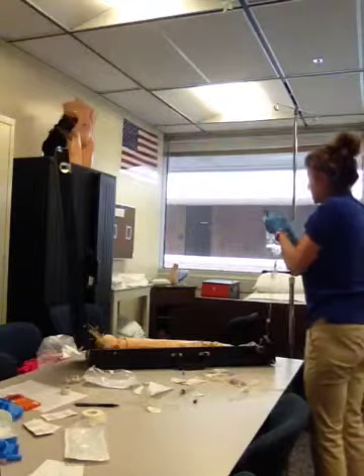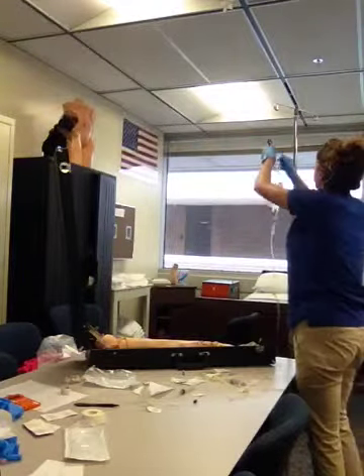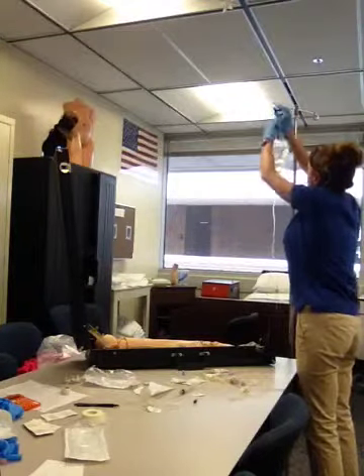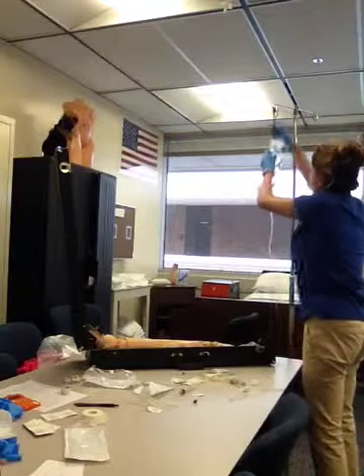This is what happened after simulation too, when we were practicing. I had to mess with it till it stopped. Here it is. All right, so y'all want to just fill in the IV first and get that done.